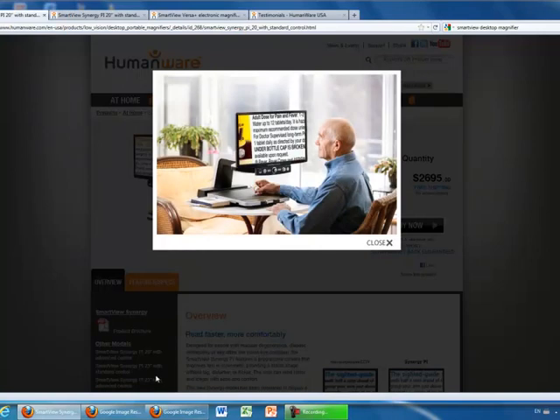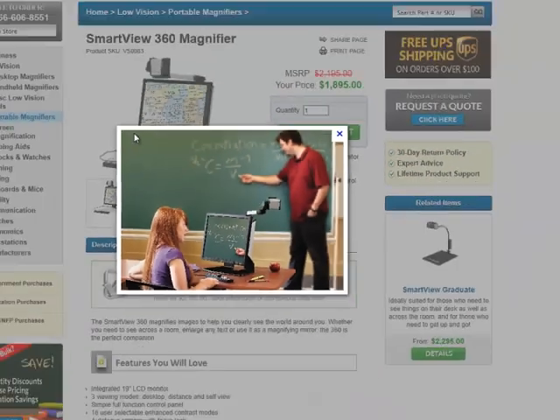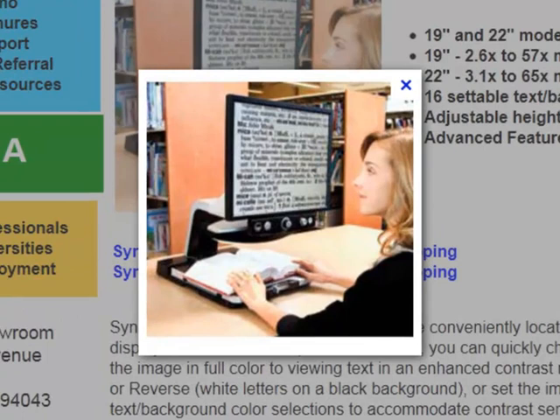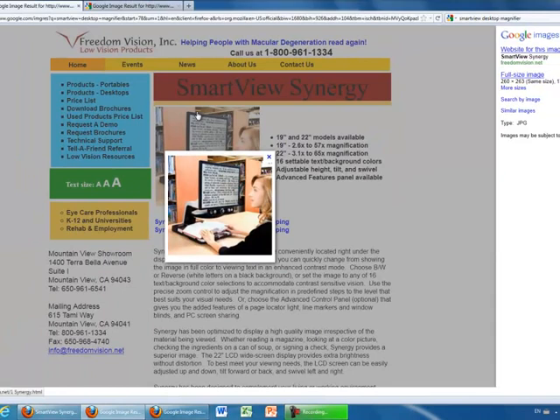In the classroom, the SmartView Magnifier can be used to fill in worksheets, see the blackboard, or read from textbooks. This technology assists visually impaired children in the classroom with tasks that would otherwise be frustrating. It removes the difficulty of struggling to see what's going on in the classroom, allowing them to focus on learning instead.